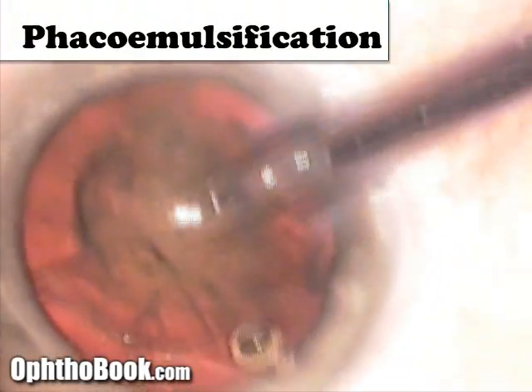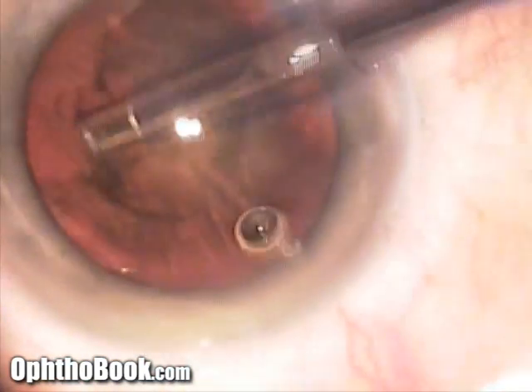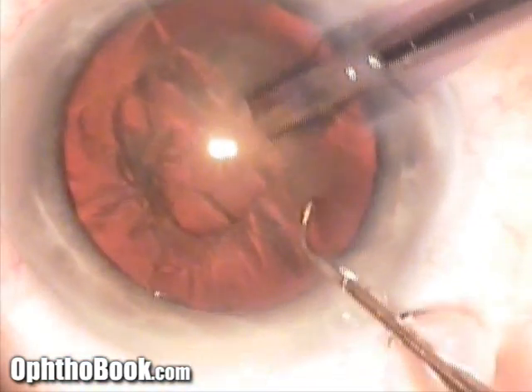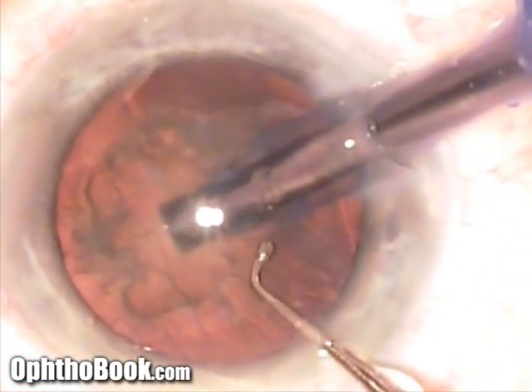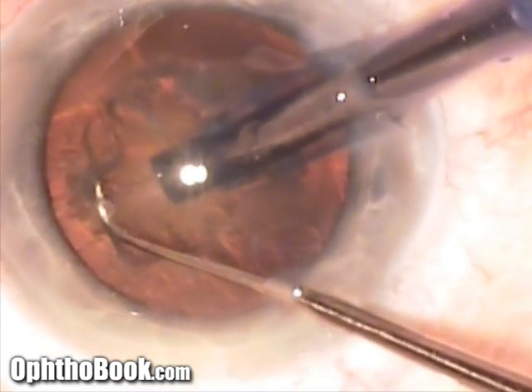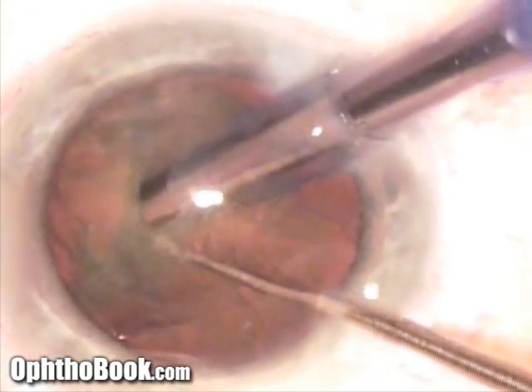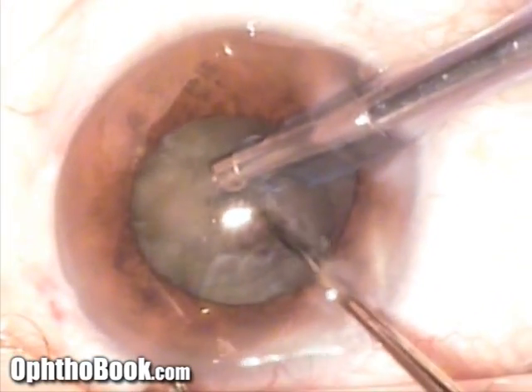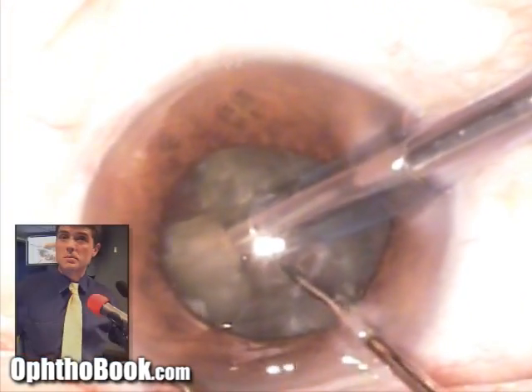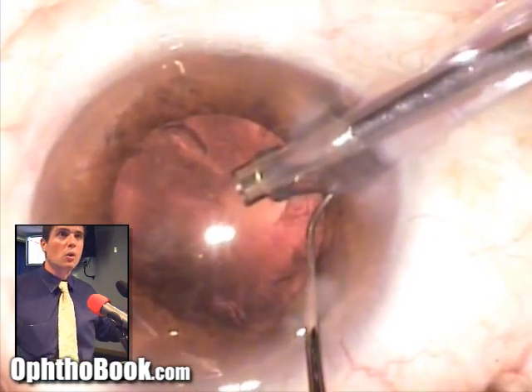Here is our phacoemulsification machine. The first step is to remove some of the superficial cortex that's in the way — it's actually clear, like jello, not brown like chocolate. Rather than divide-and-conquer, I prefer a horizontal chop technique: I ram my instrument into the cataract, take my second instrument, and crack it into two big pieces. The peanut is split in two and we remove each piece individually, sometimes cracking the larger piece a couple more times. The smaller the pieces, the less energy required.